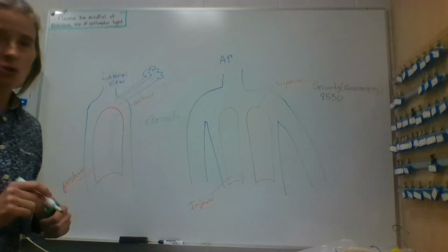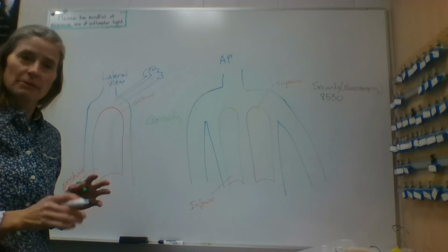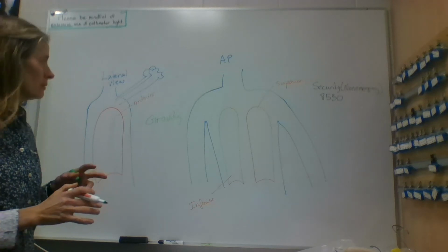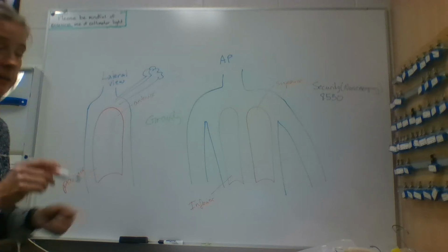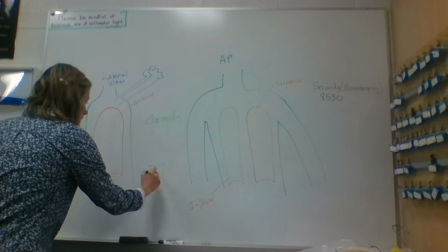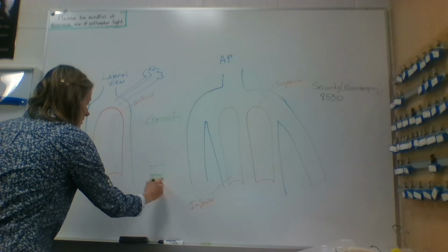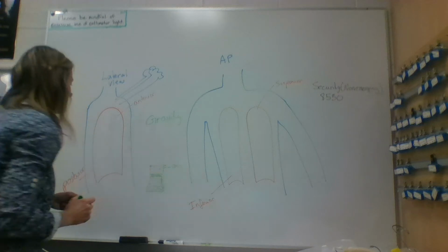If we're looking at a pneumothorax, the chest tube, and this is how you can tell whether it's a pneumothorax or a hemothorax. Air rises, right? We have our glass of water. Fluid versus air.